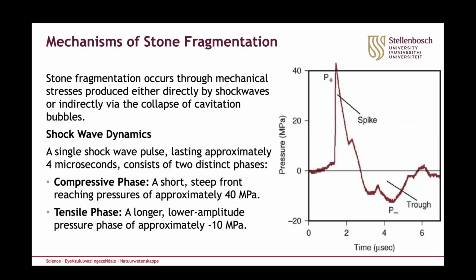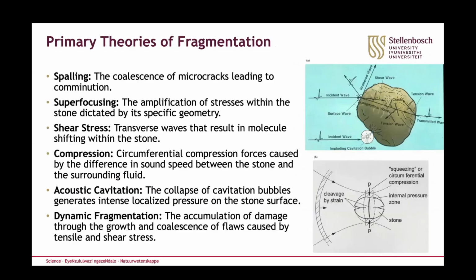Shockwave dynamics looks at a single shockwave pulse, which lasts approximately 4 microseconds. It consists of two distinct phases: the compressive phase as well as the tensile phase.